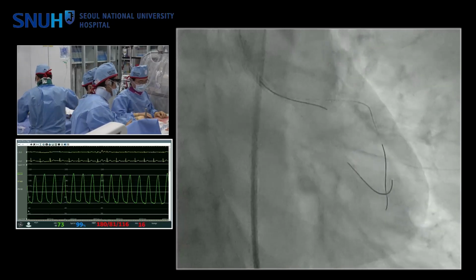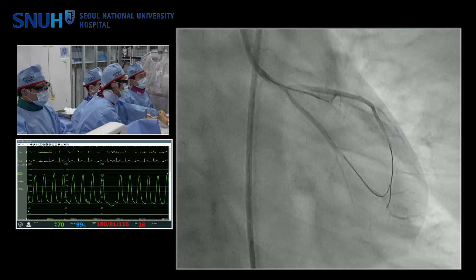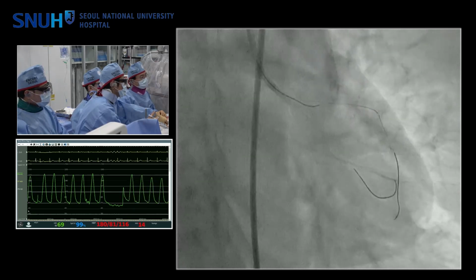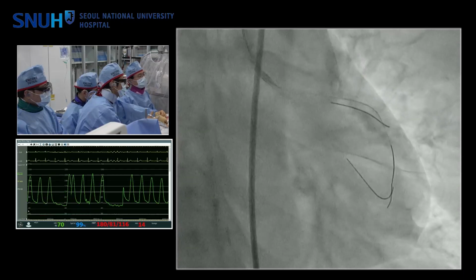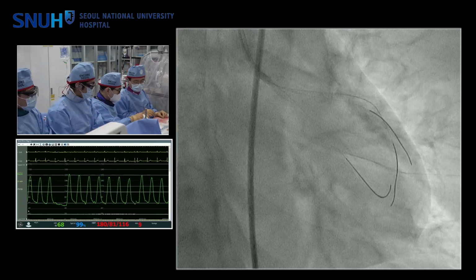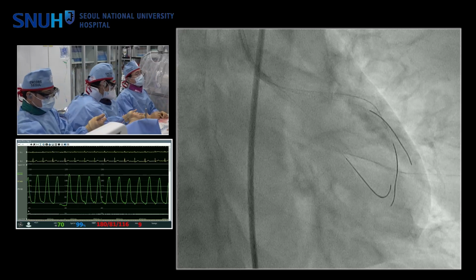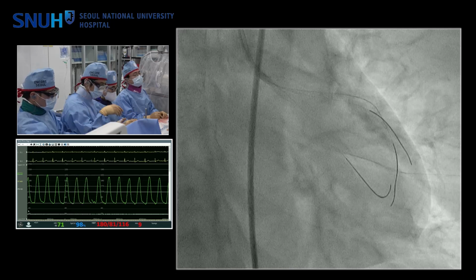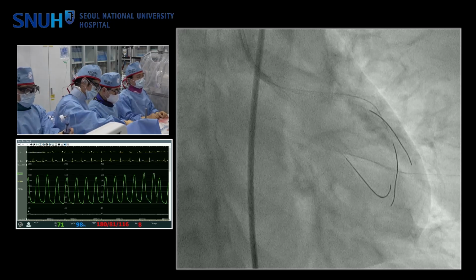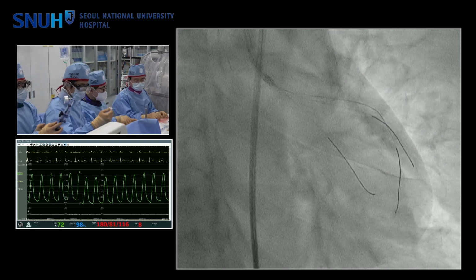Well, is anyone using the Zabo technique? I personally like to use Zabo, and I find it very reliable. Will you explain the Zabo technique? Well, basically, you inflate the first strut of the stent outside of the patient, and then you insert a wire through that first strut and crimp the stent back on. Then, when you are inside, the inserted wire will be in the sinus and serve as a stop, so that when you push, the stent will never go inside. But you can maintain the position to cover the ostium in a very confident and reliable position.